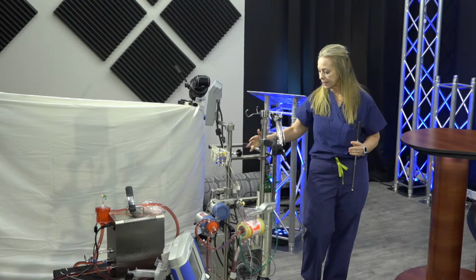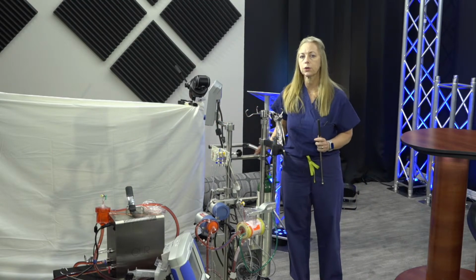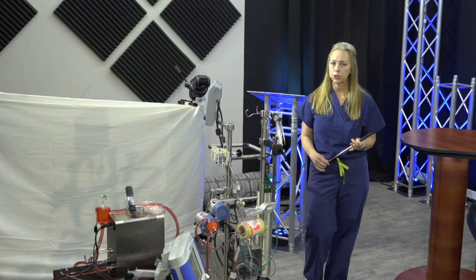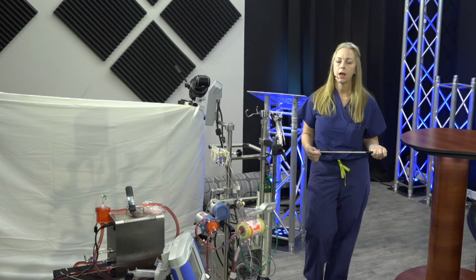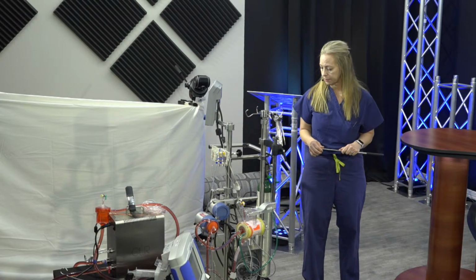They can have bigger bases. They don't really pull away. They can't get the monitor off. So those are all considerations. If you're purchasing new equipment, or maybe you're starting a new ECMO program, those are all things that you need to be thinking about and considering.